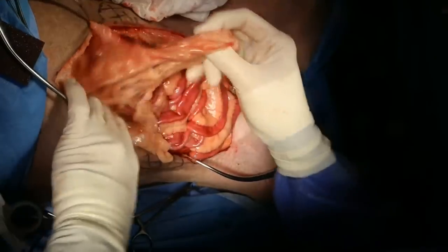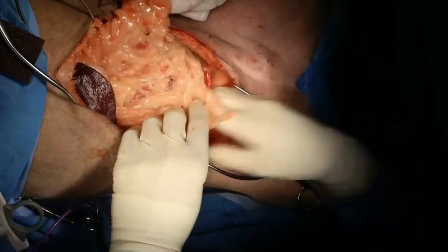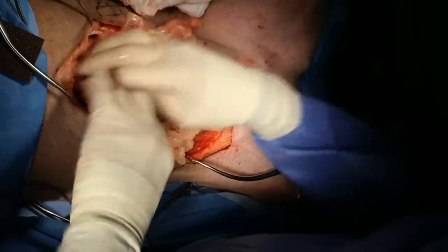So I'm just going to get our omentum up here. And we'll start suturing our omentum down to the body wall so that the intestines aren't rubbing up against the mesh.